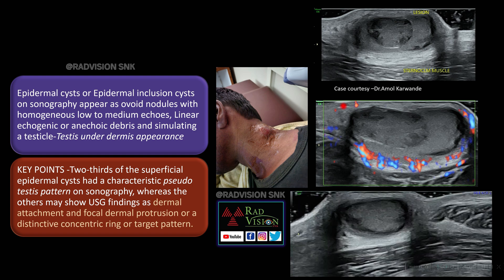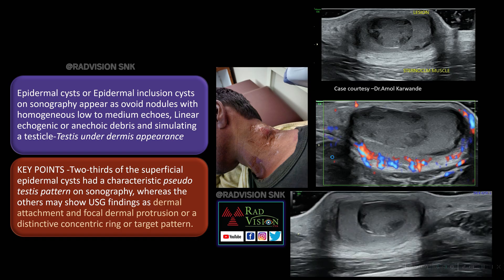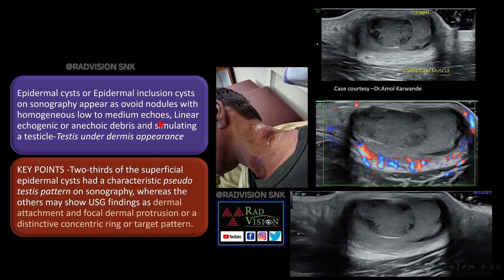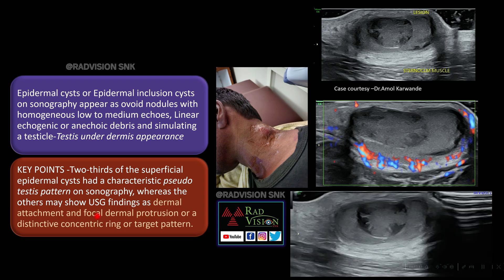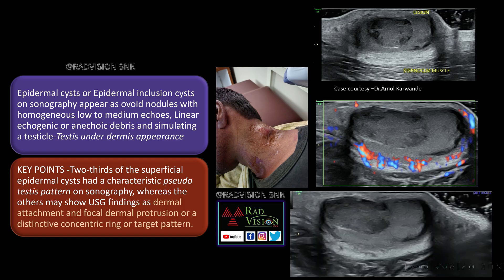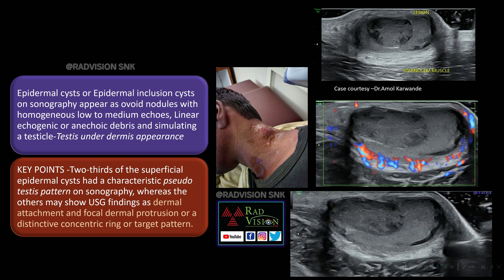The next case shows a soft tissue mass lesion in the neck, presenting as a well-defined hypoechoic lesion with multiple medium to low-level echoes mimicking a testis — the pseudo-testis appearance. Whenever you see a soft tissue mass lesion with pseudo-testis appearance, definitely suspect epidermal cyst or epidermal inclusion cyst. Other classical imaging features include multiple low to medium level echoes, linear echogenic or anechoic debris, dermal attachment or focal dermal protrusion, and sometimes a concentric ring or target appearance.